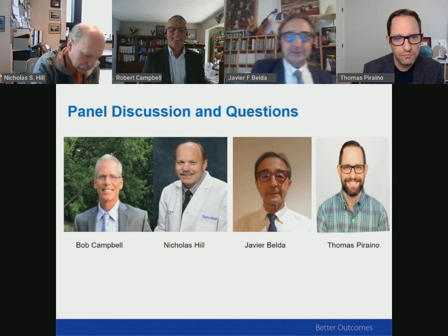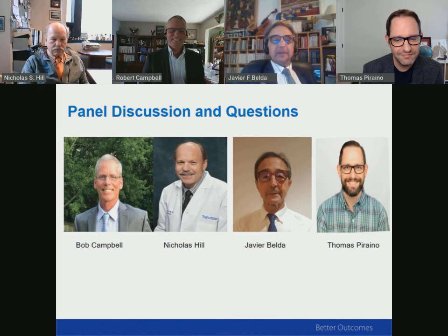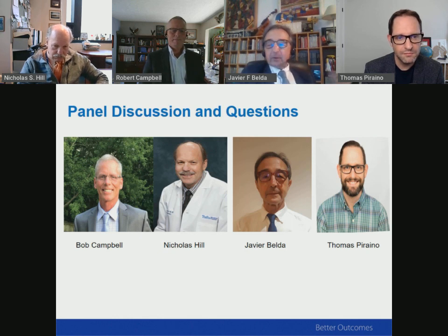Just five seconds to say that in COVID patients with high flow, the patient was still breathing deeply, with a high effort. I don't know if a higher flow would improve these patients, because we have a limit at the bedside because of the machines. But if you see that there is a big effort, try to change the modality. Monitor the patient, and if there is not a good effect, you have to change the therapy, escalate the therapy. It was a question from the audience.